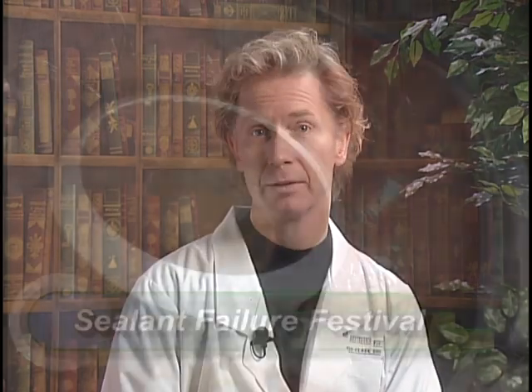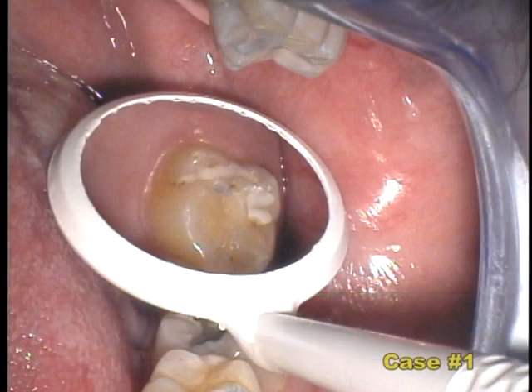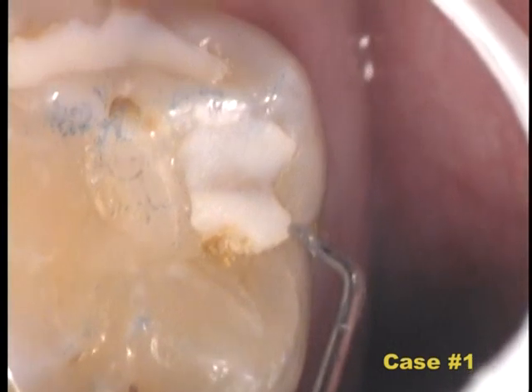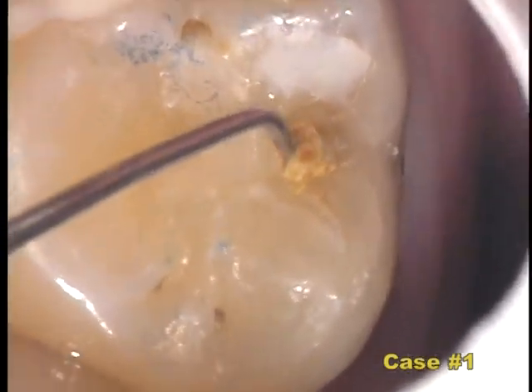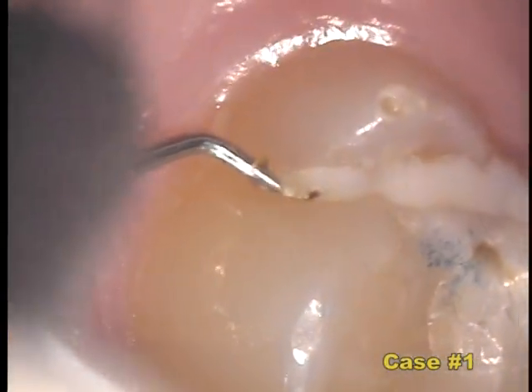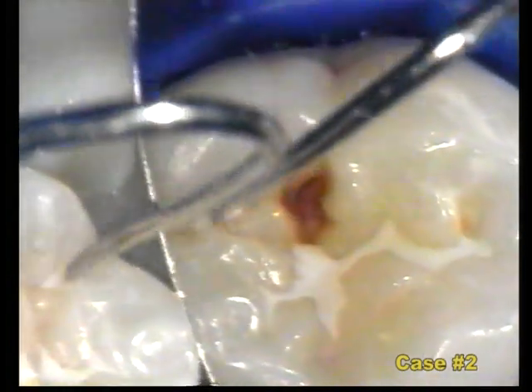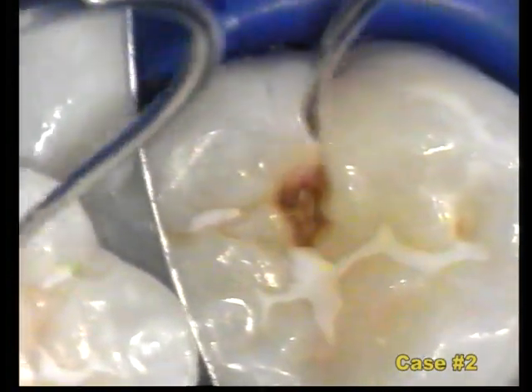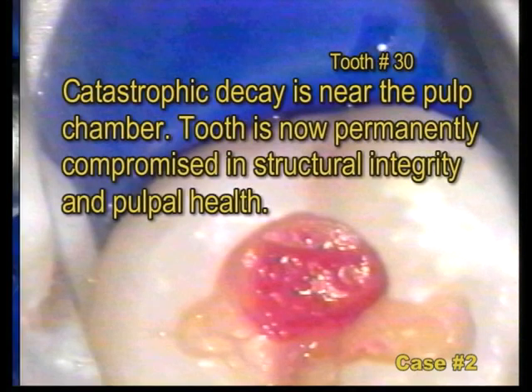These sealants were placed by well-meaning dental professionals and have been in service for less than two years. In case one, we see obvious leakage and active bacteria and decay. In case two, we see that part of the sealant is still in place, part has fallen off, and serious decay is progressing. The red caries indicator dye shows the decay has progressed under the sealant.